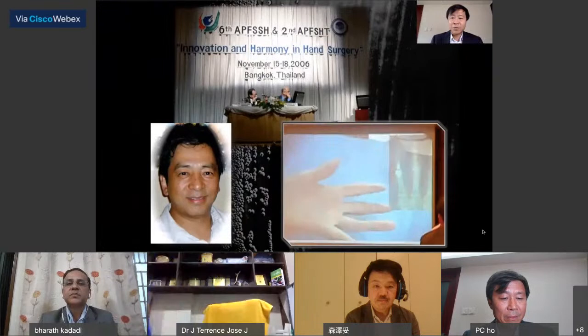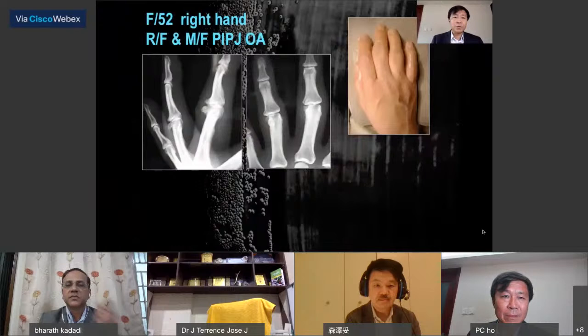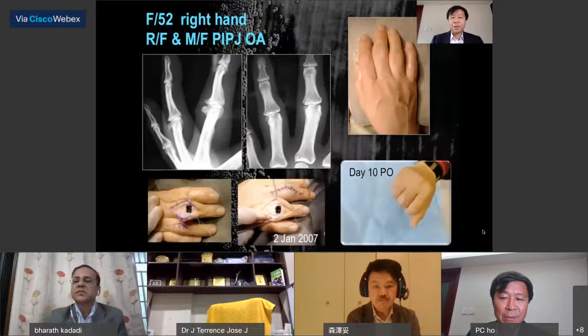The opportunity to use the implant came when I had this patient, a 52-year-old lady, presenting with osteoarthritis of the ring finger and middle finger. At that time, I was using the pyrocarbon implant as my main weapon, and that case was done quite nicely. I obtained a nice range of motion and the patient was happy about the outcome. But that's not the end of the story.